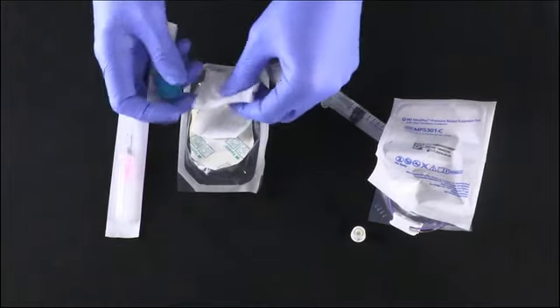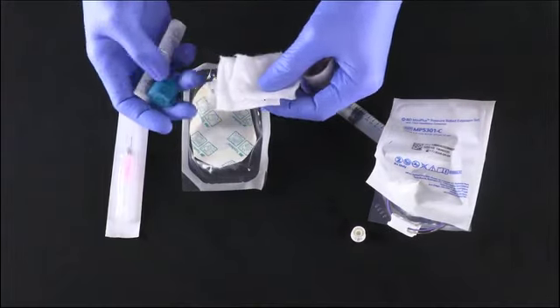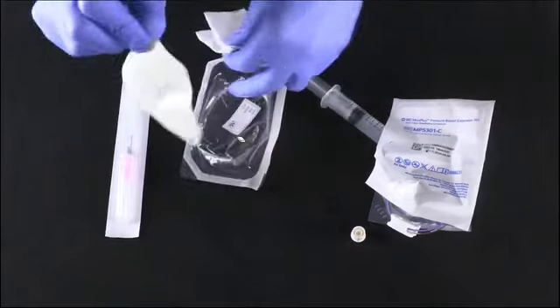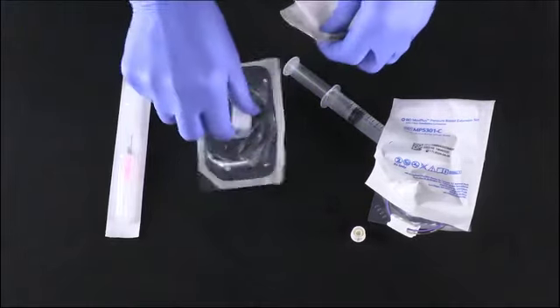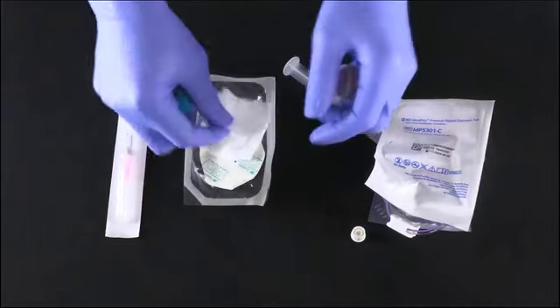And so the micropore tape is one of my favorite tapes to absolutely use. And then you also have your transparent dressing here. And then the other cool thing about this kit is it actually has this little time, date, and initial sticker, which is very, very, very important.